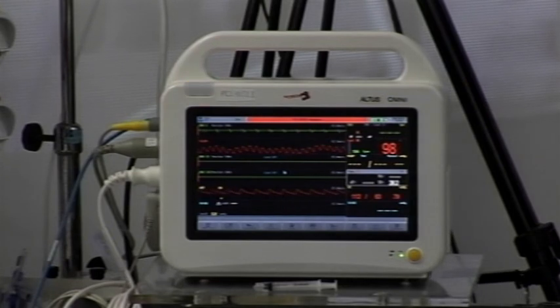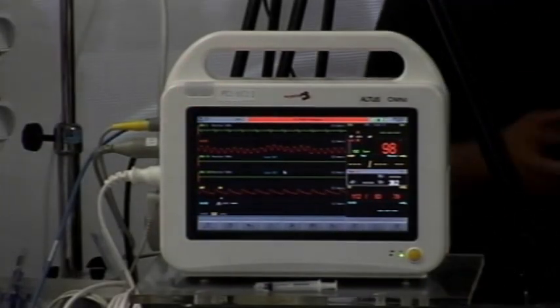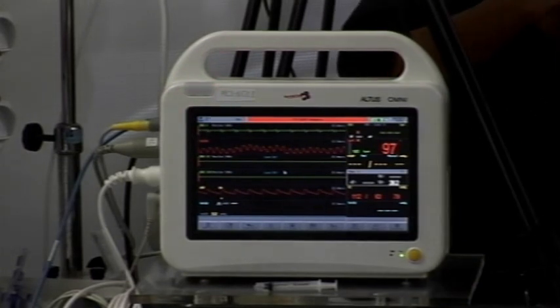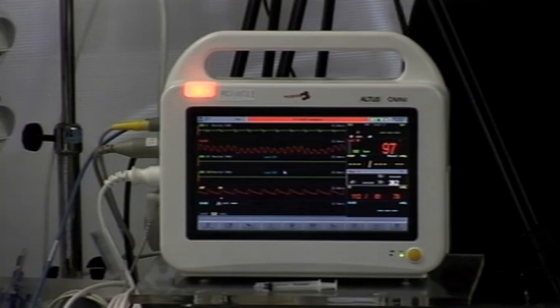After we have optimal lung volume, we would like to wean down. How about your experience? How long? When we wean down, is it fast or do we still wait a while? Okay. Each baby is to be taken individually.